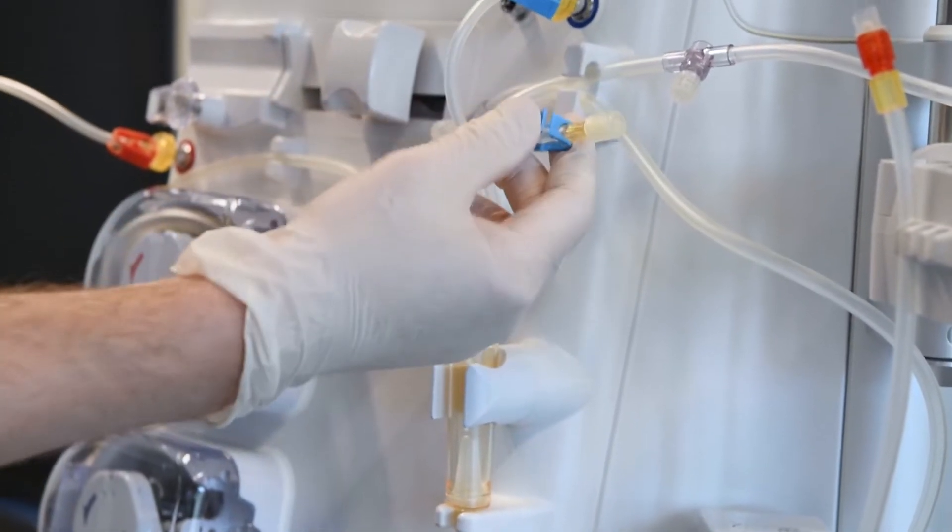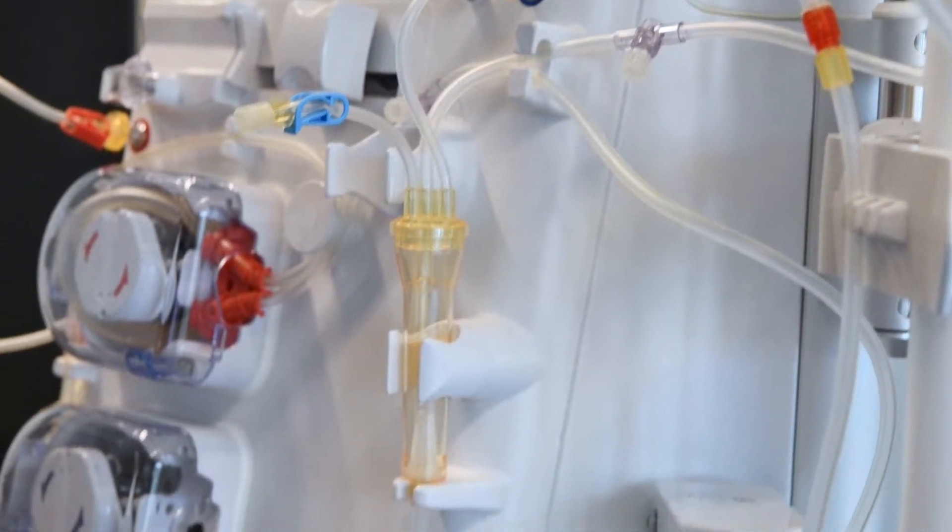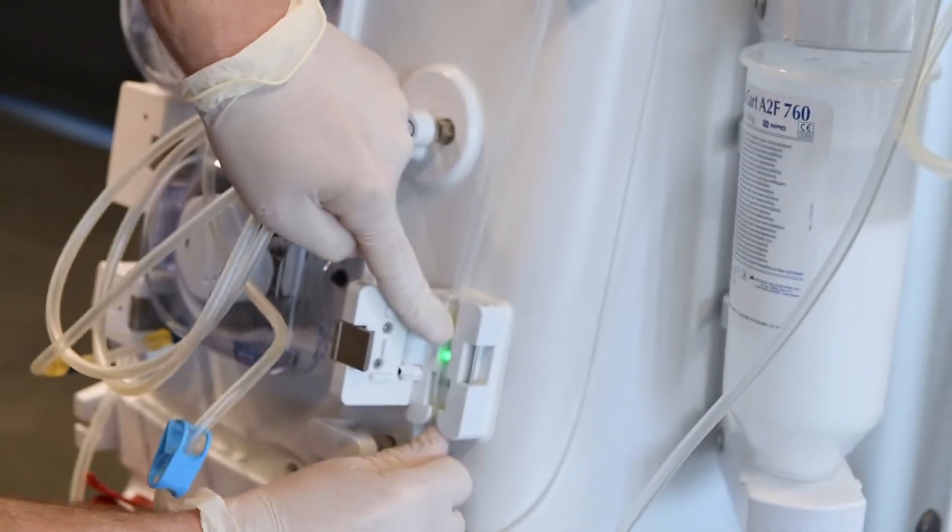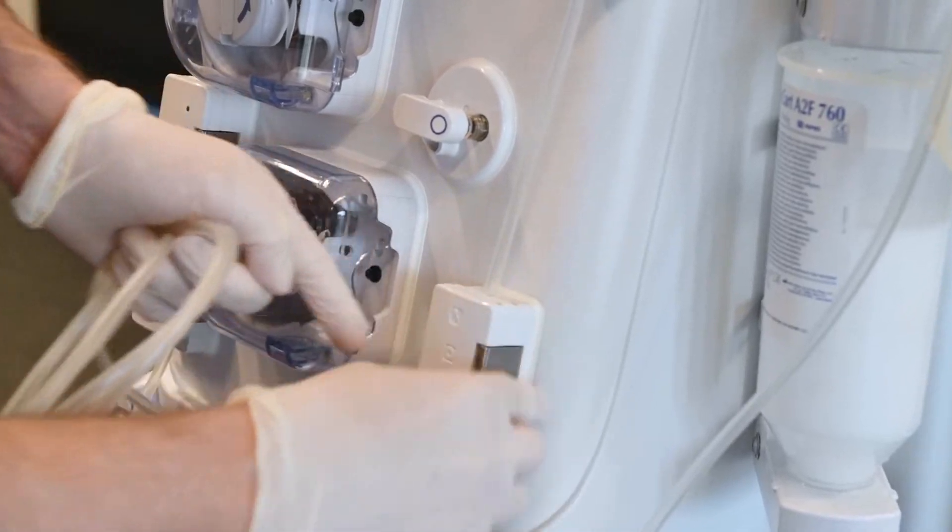Connect the venous pressure line. Place the line through the clamp box and close the door. Pull and turn the drain port cover and connect the venous line to the drain port.